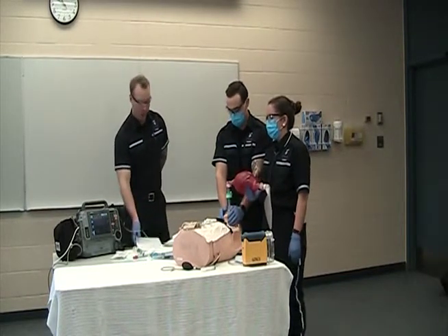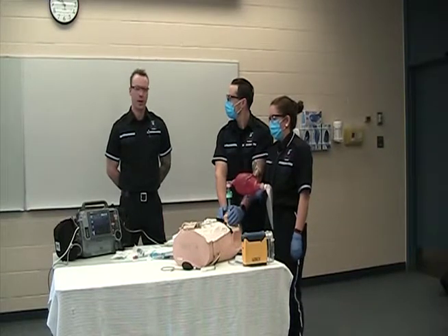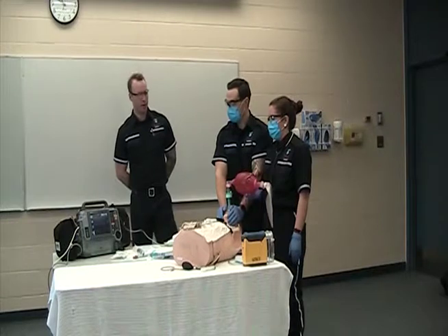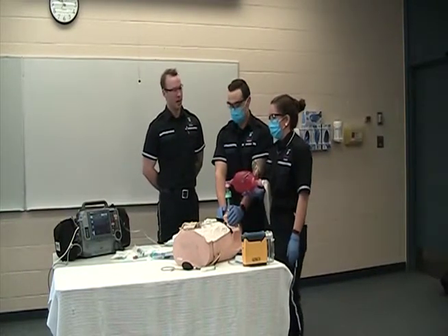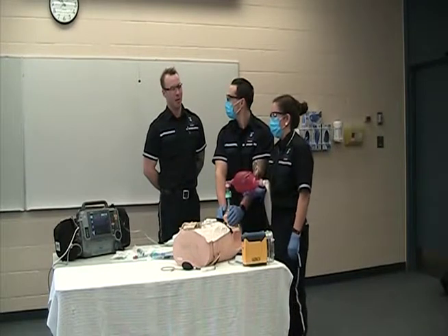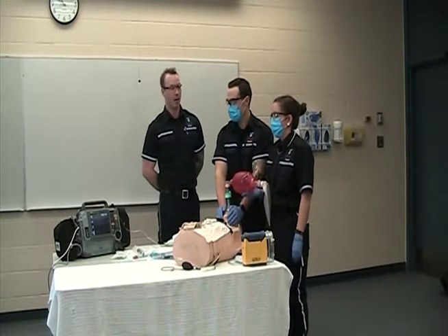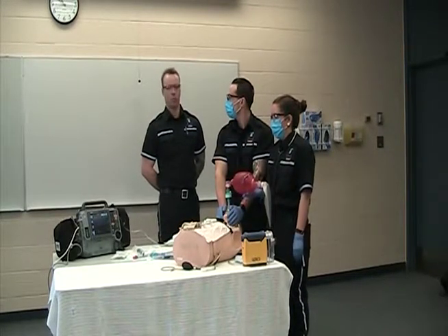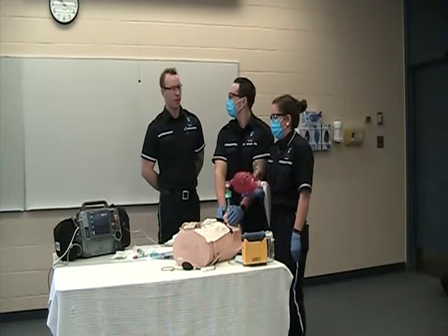So at this point, we've been pre-oxygenating the patient for 2 to 3 minutes. I think we're ready to intubate. So I'll delegate my partners their tasks. Rob, you're going to provide ELM when I ask. And Jill, you're going to count down 30. You're also going to let me know if the SpO2 drops below 85. If it does drop below 85, we'll go back to pre-oxygenating. And then also, would you be able to listen to breath sounds?